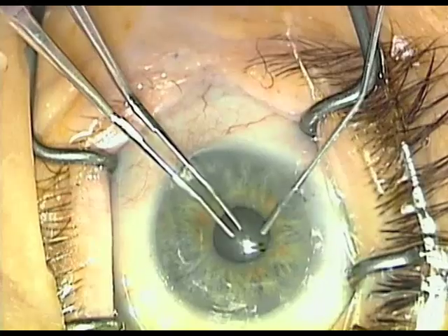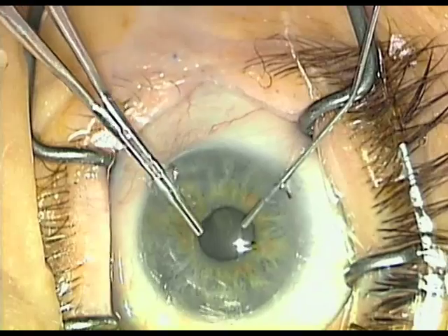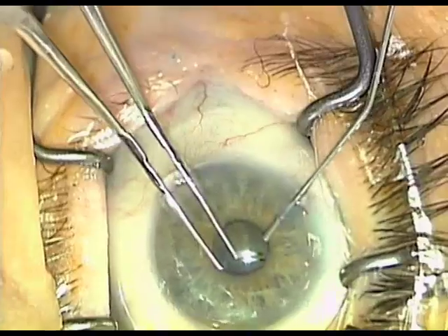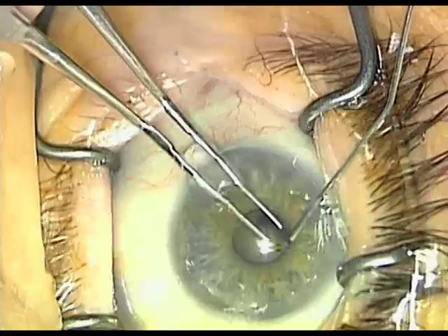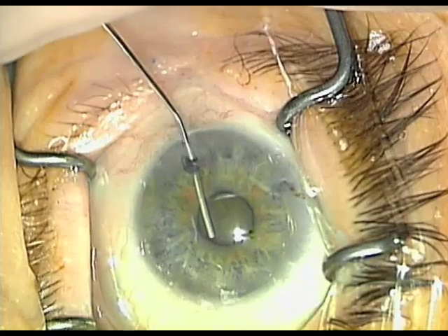That's why I leave the eye only partially filled. Also important: leave the eye partially filled in glaucoma so we don't excessively increase the intraocular pressure. We also will perform the capsulorhexis underneath the iris plane by leading the capsule always in a forward direction.